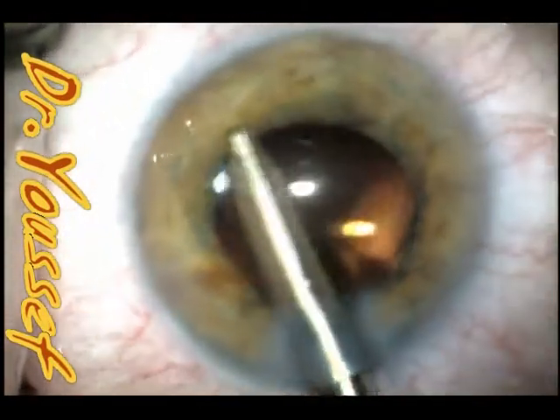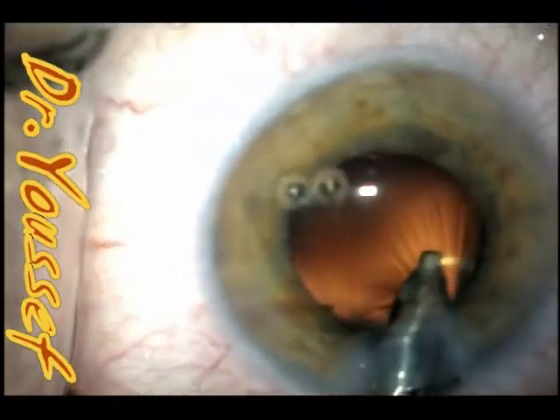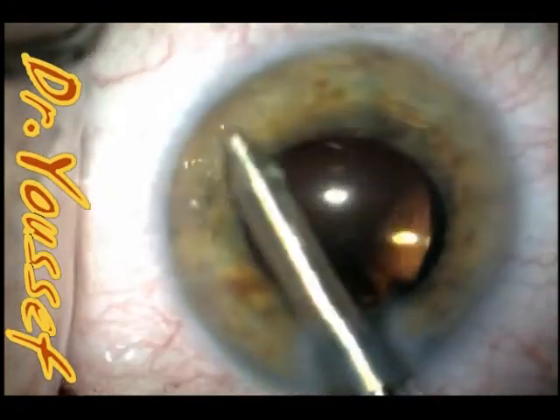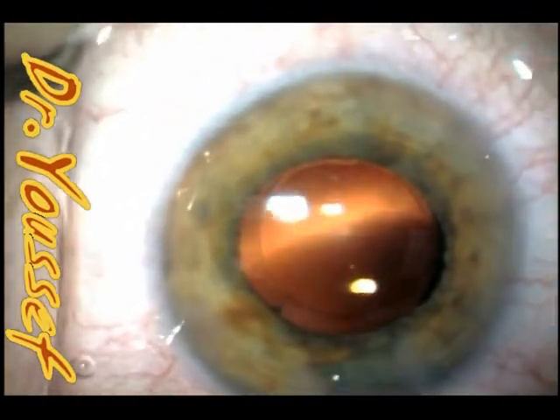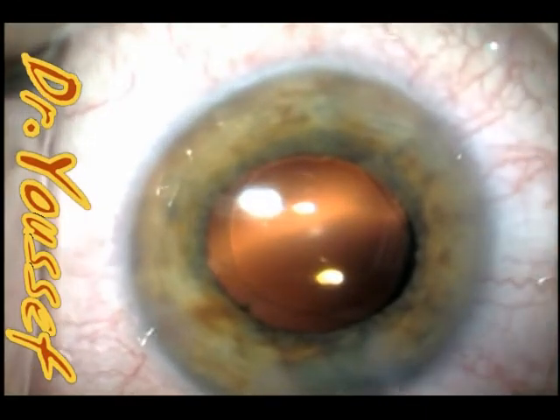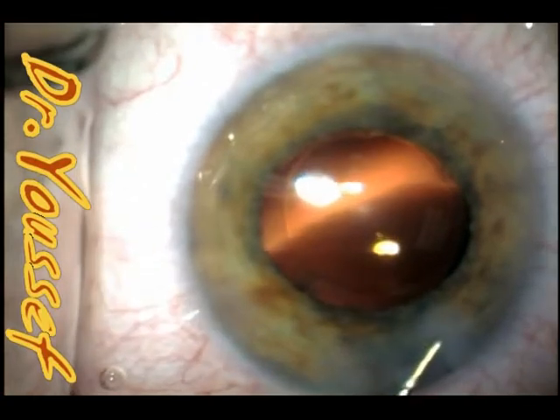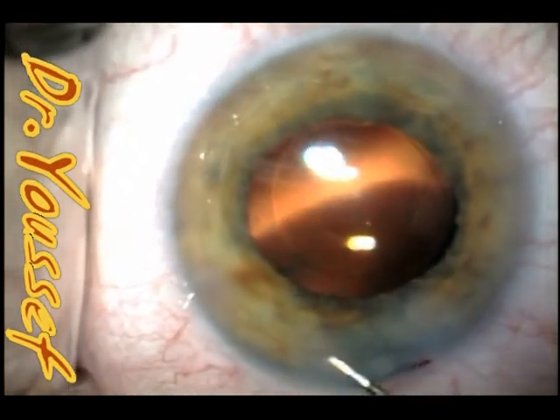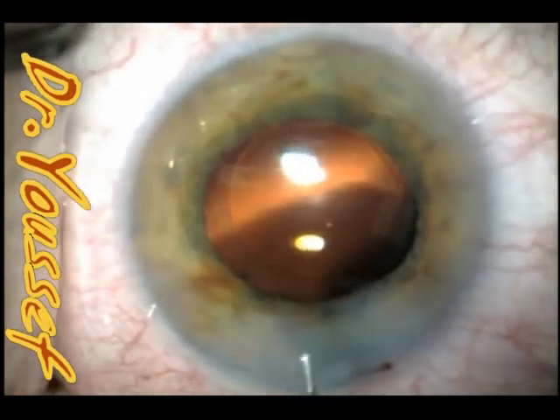Be careful in cases of small pupil — material can be hiding somewhere and you might discover a little piece of nucleus or cortex, so be extra careful looking for residual material. You can use irrigation to stir things up and find any remnants. The wounds are then hydrated — I inject Avelox to protect against endophthalmitis, hydrating the wound edges, paracentesis sites, and applying some inside and on the outside.